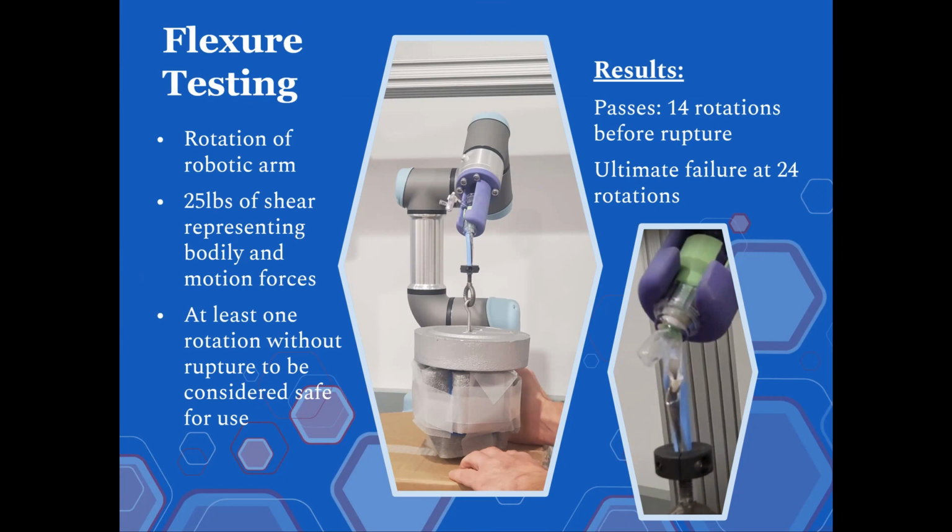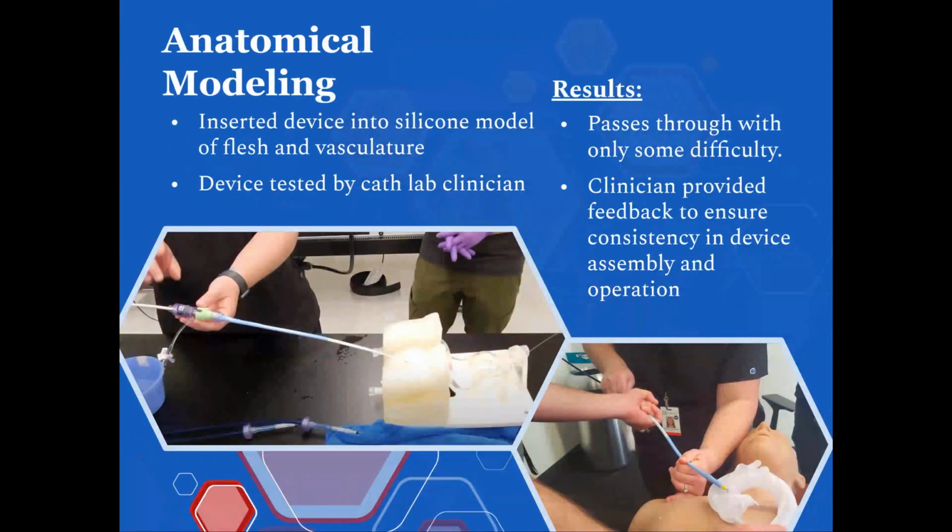Finally, we had a clinical specialist practice using our device on a silicone femoral model. She then gave us feedback on our methods.